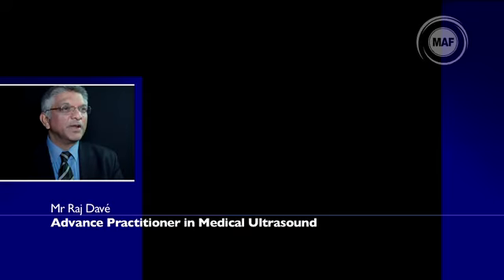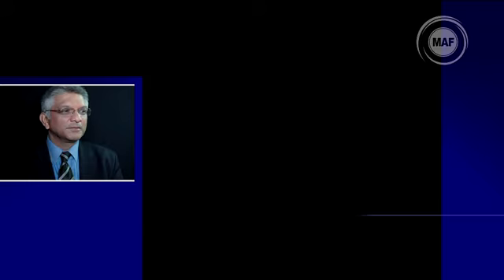My name is Raj Dave. I'm an advanced practitioner in medical ultrasound. I'm going to talk about the basic anatomic scan, the anomaly scan from head to toe, the normal views.